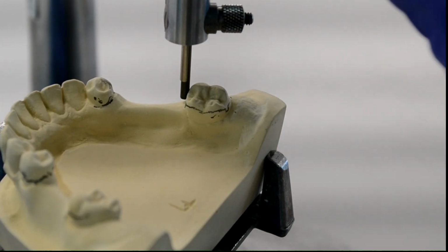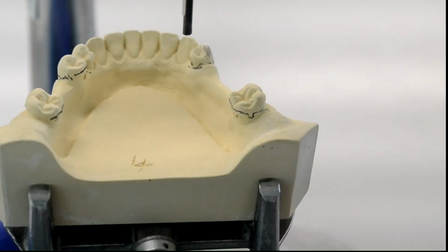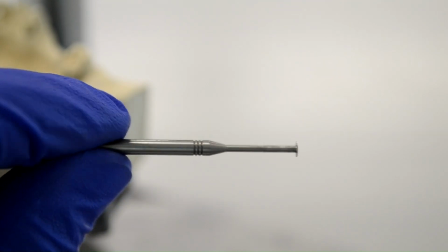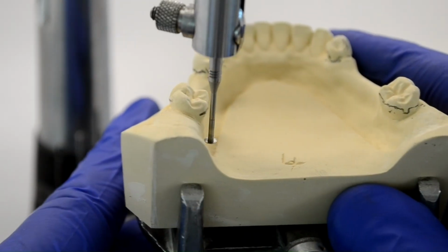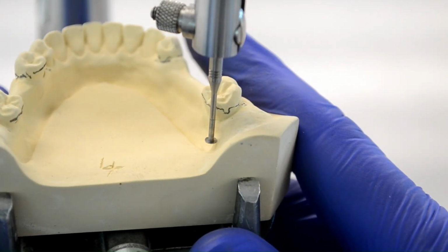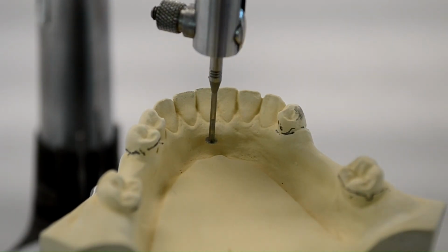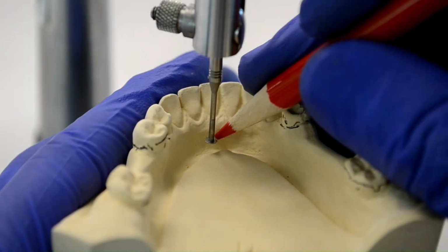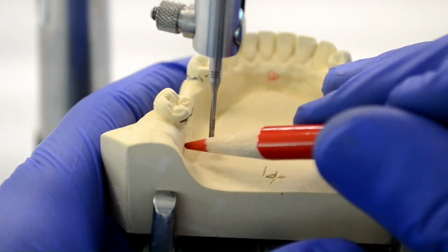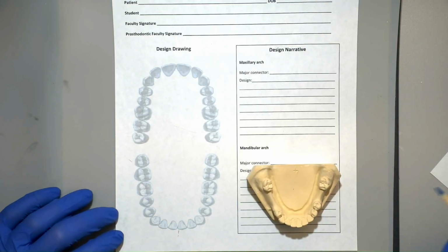With this, the surveying is completed, but in order to save the position of the cast, we need to tripod it. This is done using a .03 undercut gauge. The .03 undercut gauge is attached to the mandrel, and the mandrel is lowered so that it would allow that undercut gauge to touch the cast at 3 different areas without having to move the mandrel up and down. A red pencil is then used to mark each area of contact with the undercut gauge on the 3 different points on the cast. Now we're going to go ahead and draw our design on paper.